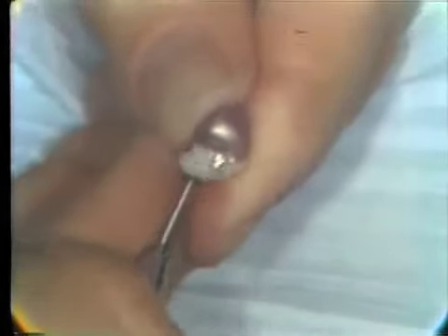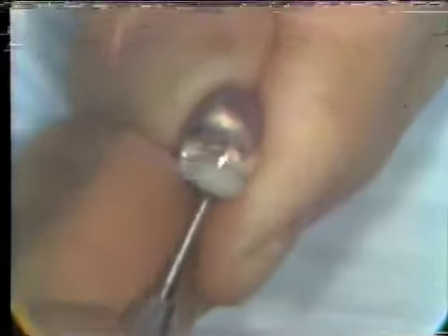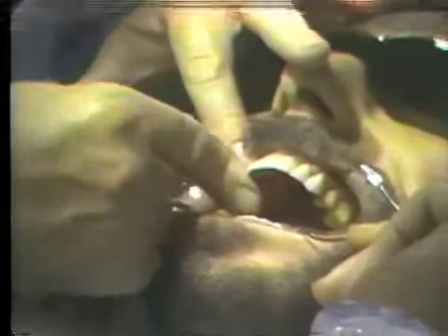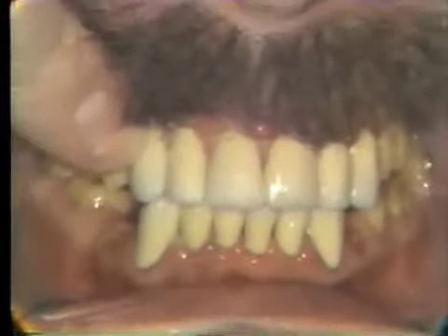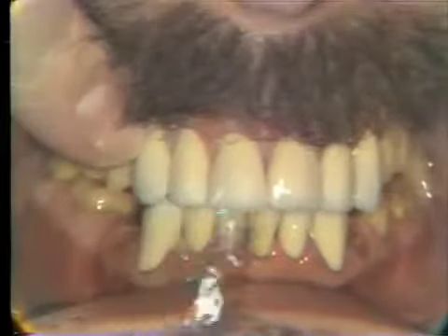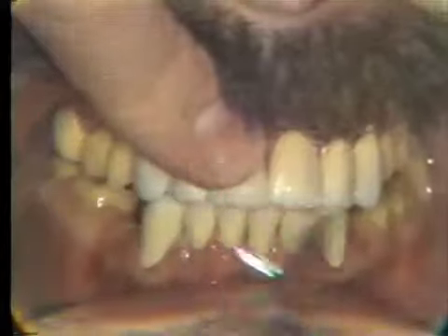There should be no irregularity as it comes from porcelain to gold. Okay, close. Tap, tap. Now we still want to maintain contact. Open, please. Close. Open, close.